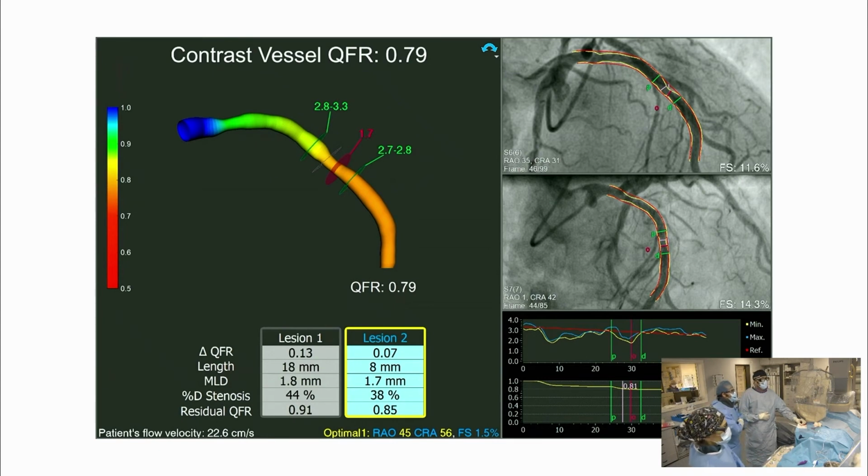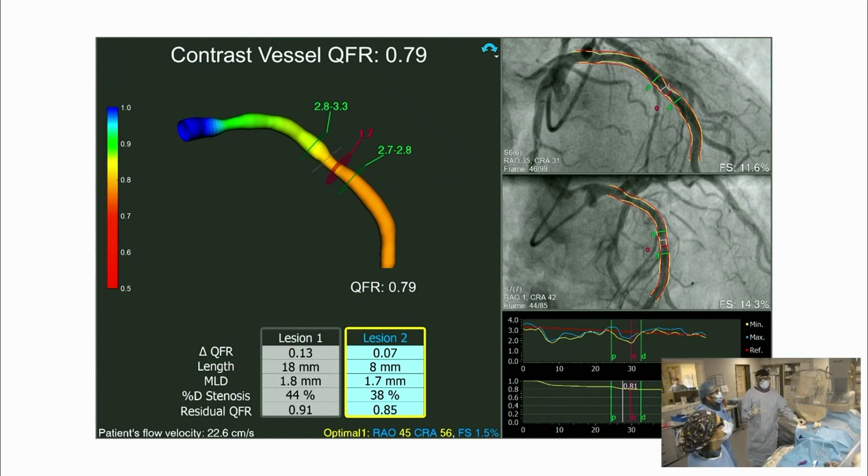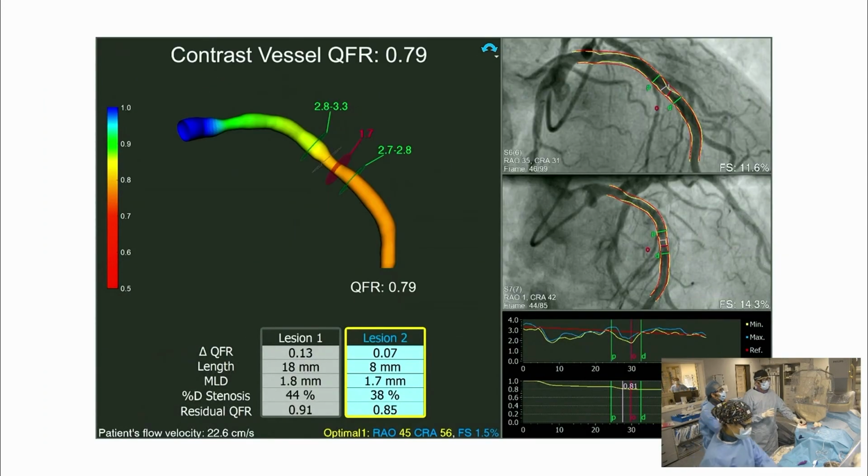But in any case, considering the previous aspects that Javier and Brida have commented about this patient, we decided to defer this vessel because of the very borderline QFR value. Next slide, please. And perhaps before moving to the next slide, can you go to the previous one? Thank you. Hernan, we already did a physiological measurement to confirm this. Can you show, please, the screen with the results of the iFR measurement that was performed?